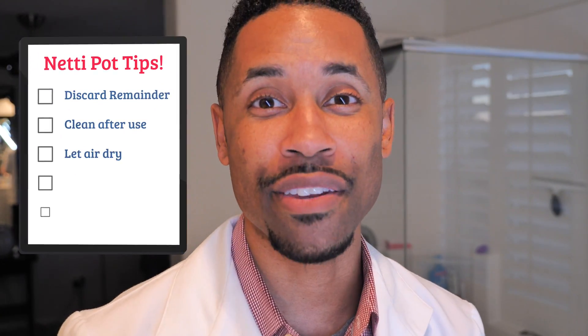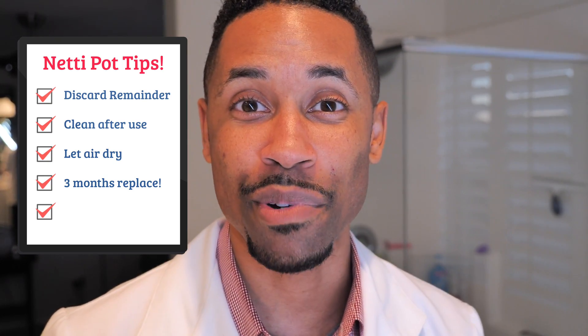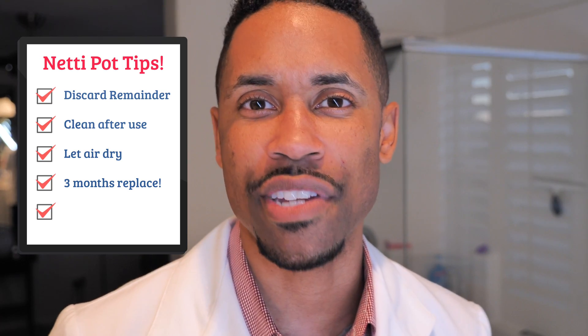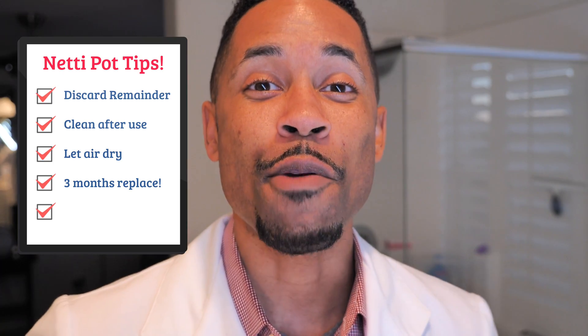Alright, that's over with. I feel pretty clear, but then again I don't really have any nasal issues — but maybe you do, so this might be something you want to consider. At the end of it, make sure if you have any solution remaining, go ahead and discard the remainder. Also, make sure you clean the neti pot after each use with maybe one drop of dishwashing liquid or even just a little baby shampoo — wash it all the way out thoroughly. Also, every three months, replace your neti pot. Buy a new one; do not keep the same one for the next three years. And if you're having any nosebleeds, fevers, or headaches after using the nasal rinse, see your healthcare provider.